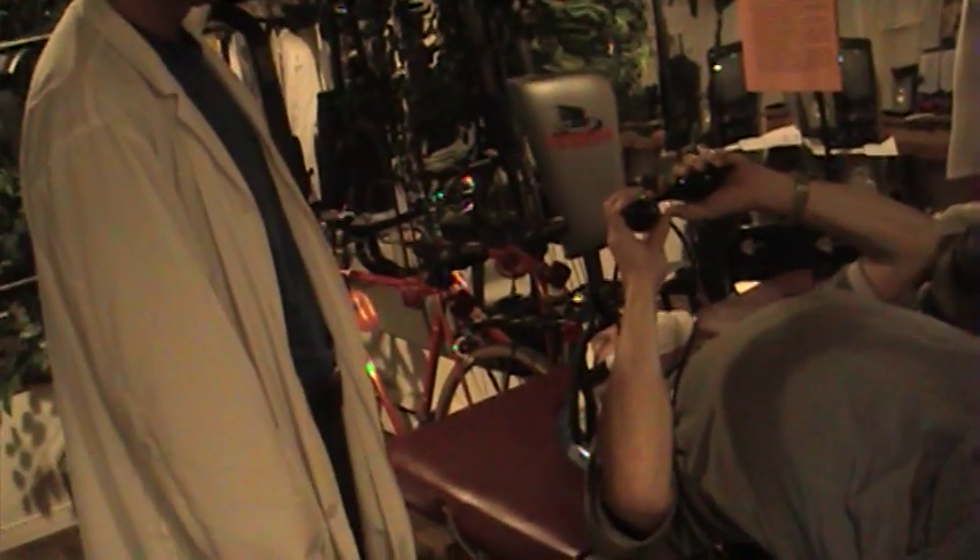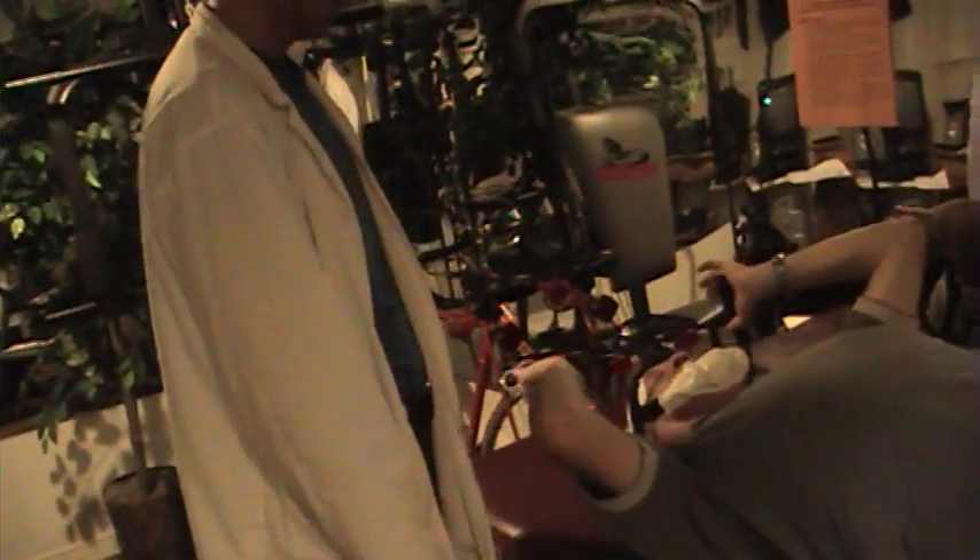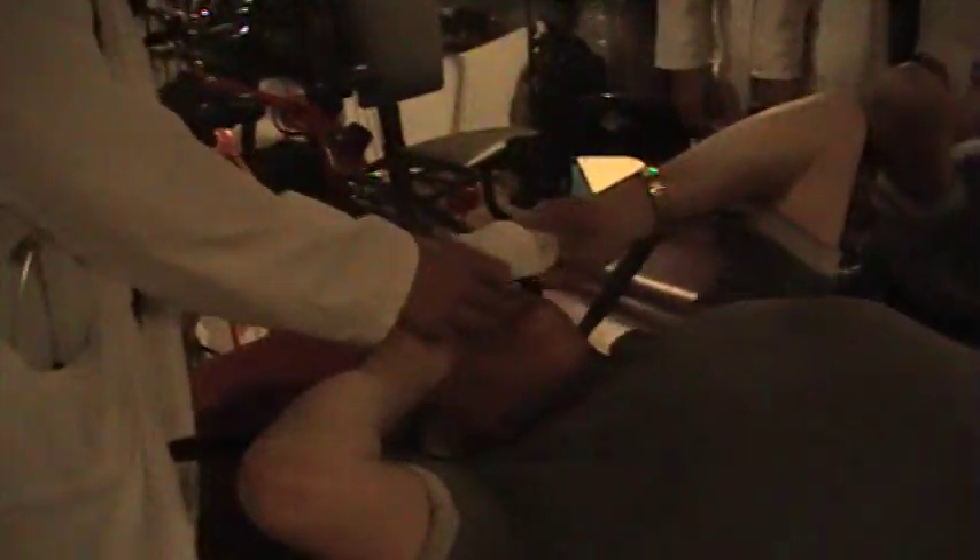Now that you've let all that air out, you're going to also let the air out of the other ones here — let those out completely. And the other one, all the way out. Then you're going to help yourself out of there — undo the Velcro, the chin piece comes up, head comes out, and you're going to get yourself up.